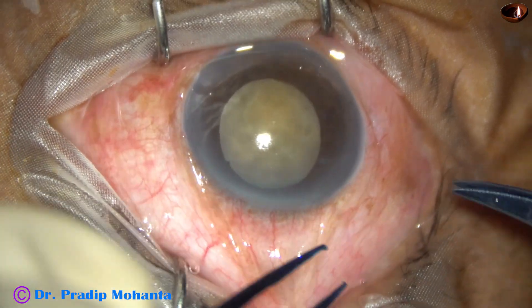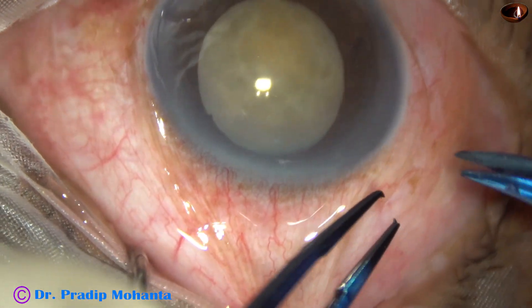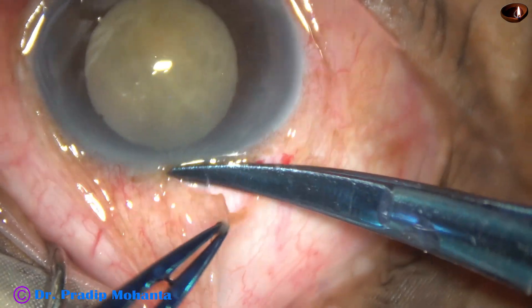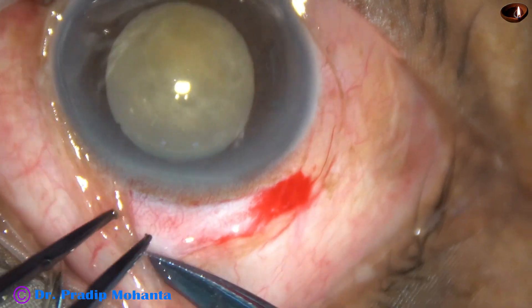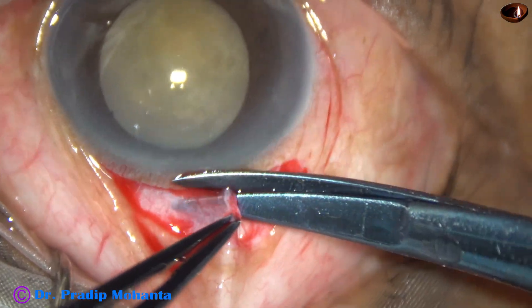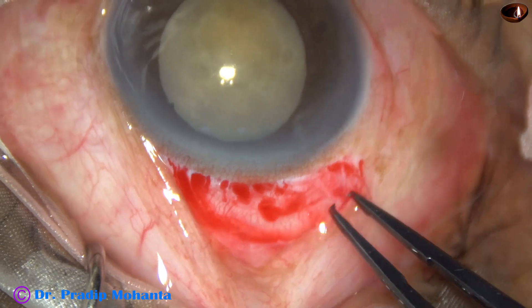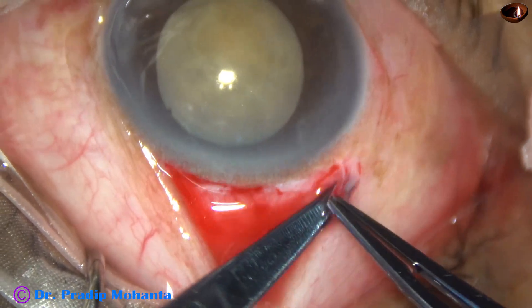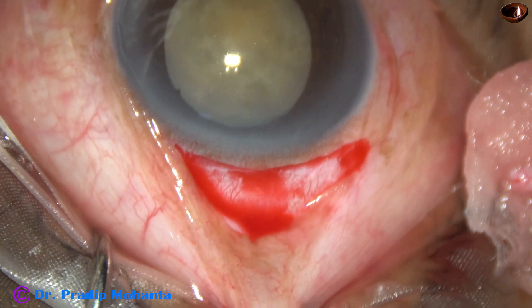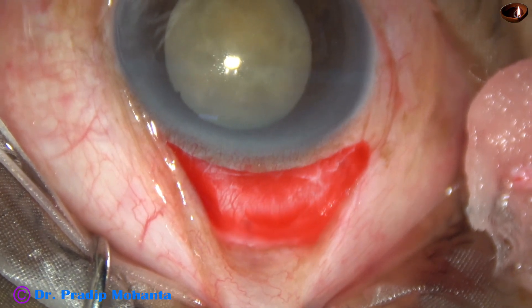This video is running at two times the real speed. This is a very interesting case — you can see the cataract and it is only the nucleus; there is no epinucleus, no cortex. What has actually happened is this cataract had been a hypermature morgagnian cataract sometime in the past. Over a period of time, the milky fluid got absorbed and now there is only the nucleus.